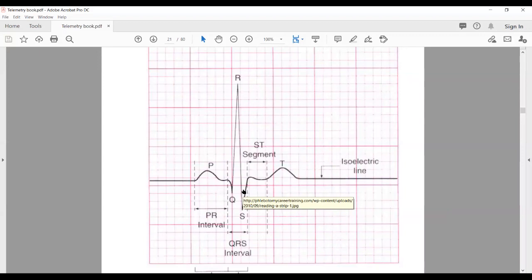So it's in a really good position, the atrioventricular node, because the AV node, which beats our heart between 40 to 60 beats, is going to send an electrical signal through both sides of the heart, to right and left, and it's going to go to the bundle of His, which is our R. I want you to think of R now as where the electricity is going to propagate to both sides of the heart muscle, of the ventricles, right? So the bundle of His electrical current, which is between 20 and 40 beats per minute, is going to give us our R wave.